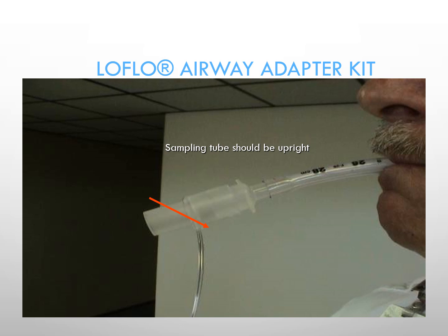So, the cure for this, if this patient was really connected to a ventilator, is you're going to have to change out the end-tidal CO2 adapter. And that's really what you need to do. The problem with that is now you're opening up the circuit and you're exposing the patient to the potential to introduce microbes into that sealed circuit, if you will.